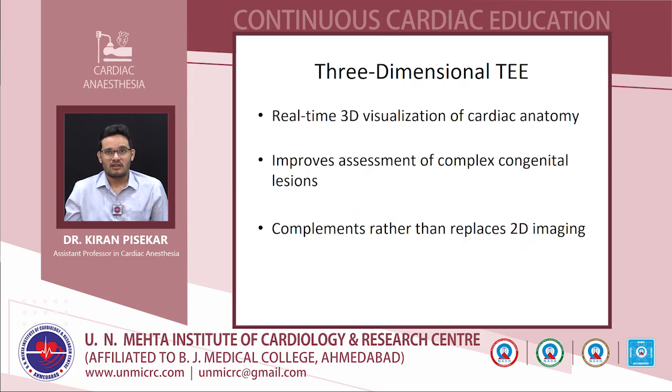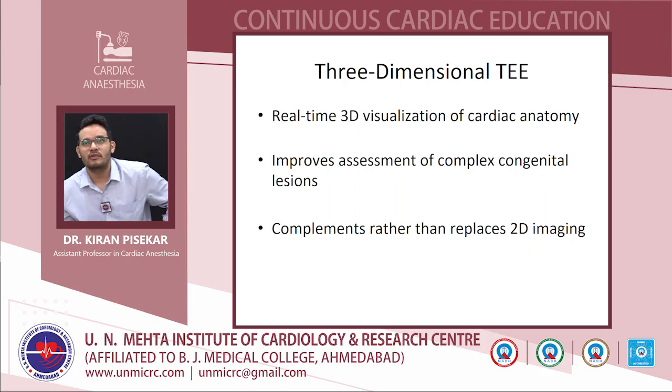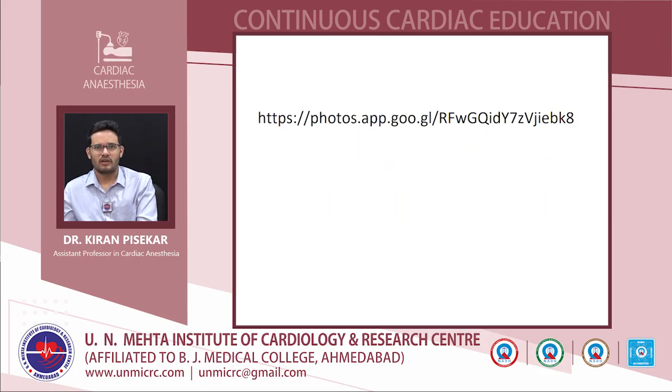Now three-dimensional TEE can be used, though its use is limited in the pediatric population. When there is an older child with adequate weight who comes for the surgery, we can use 3D TEE, but not in the low weight pediatric population. Its use is still limited. But 3D TEE is in real time. It improves the image quality, and it complements the 2D imaging.